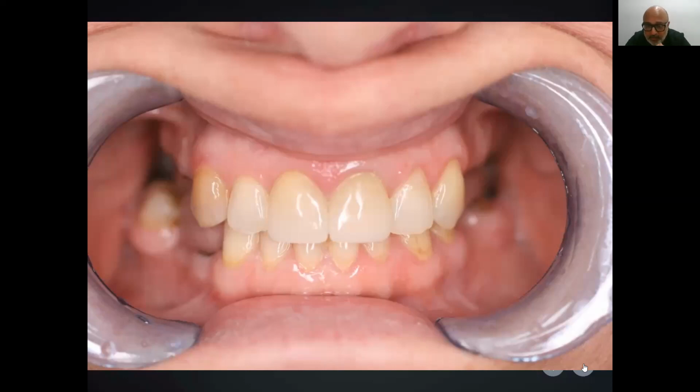The upper right canine looks darkened. Is that tooth vital? The patient probably has a biotype 2. Their posterior missing teeth, what does that mean? Are they wearing a denture? Is there a deep overbite? Are they posturing? Is there stability? I can vaguely see through that blur some decoronated teeth and some caries, root caries as well. So when you start looking at things a little bit differently, you see a picture and you should be able to say quite a lot about it.